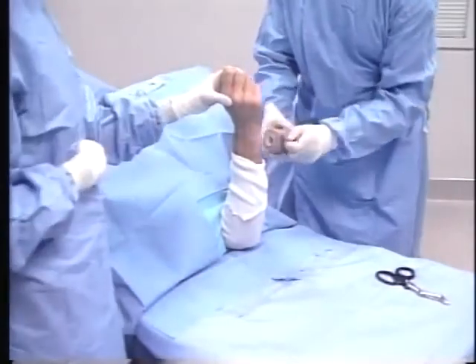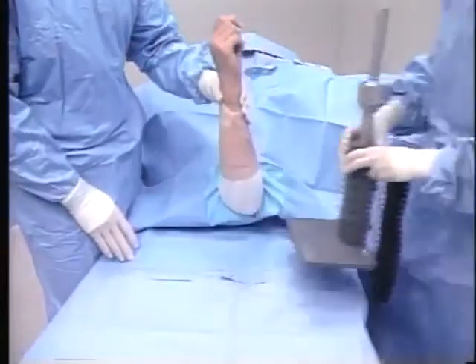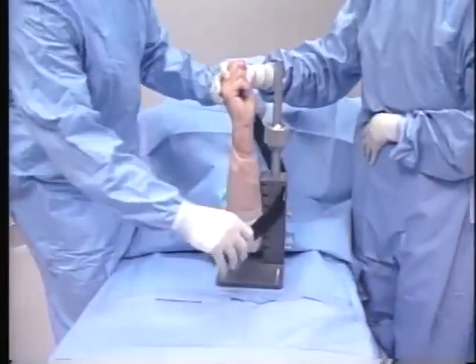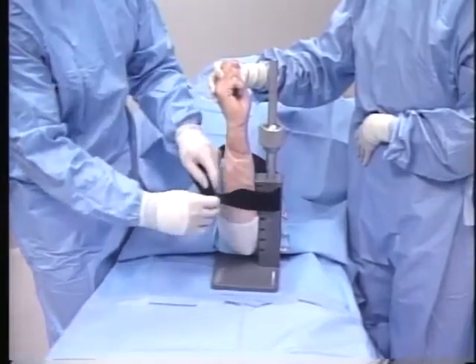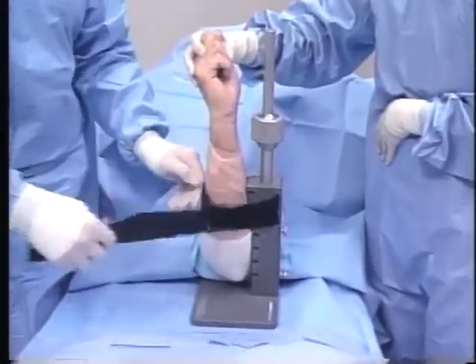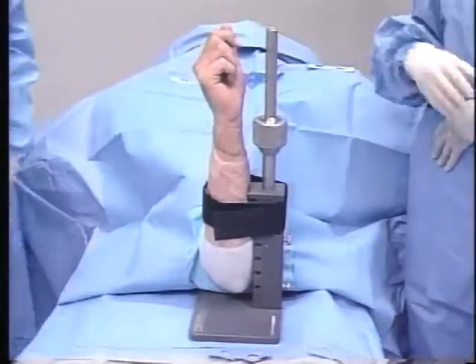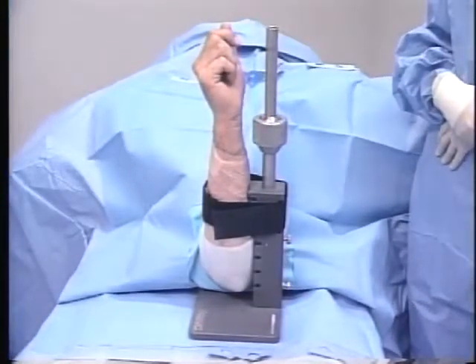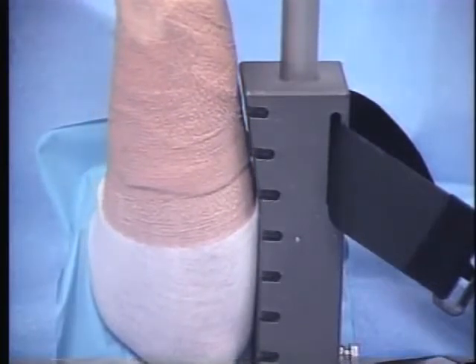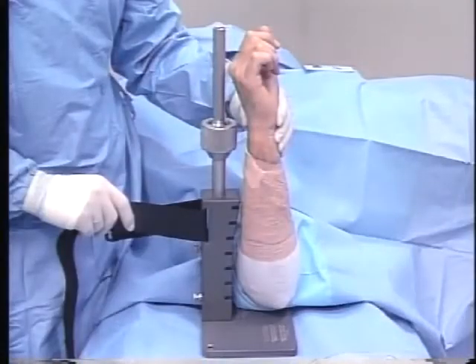The distal end of the stockinette is cut, then folded back and secured with a self-adherent wrap. The traction tower base plate and primary support, which has been sterilized and allowed to cool, is then brought into the sterile field and placed under the operative elbow within the fold of the extremity. For dorsal procedures such as wrist arthroscopy, the volar aspect of the forearm is rested against the primary support and is stabilized using the forearm strap.